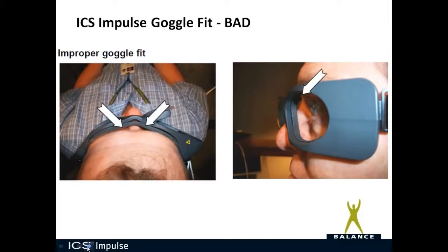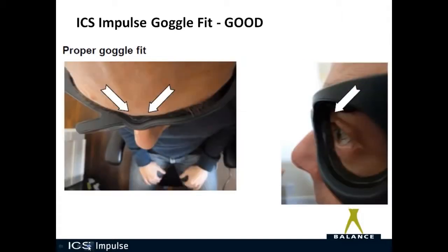Let's look at goggle fit again. If you look where the arrows are pointing, you see there are gaps between the patient's face and the foam cushion — that's a bad goggle fit. If the goggles fit like this, you're at risk that they will slip during head impulse testing. You can try removing the face cushion and using the goggles without it to see if they adhere more appropriately. In my experience, it's very rare to find a patient where the foam cushion fits this poorly. Here is an example of a proper goggle fit — no gaps from the side or top, and the face cushion is adhering to the patient's face, which is what we see most of the time.